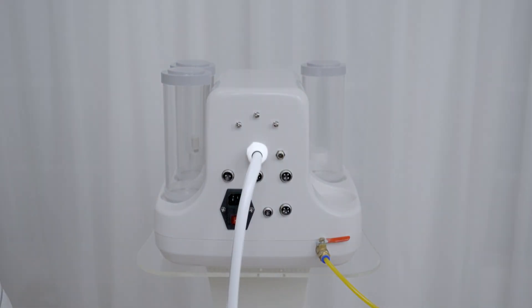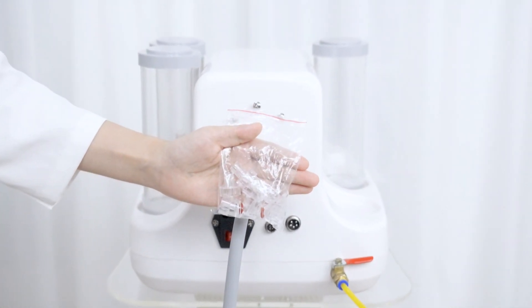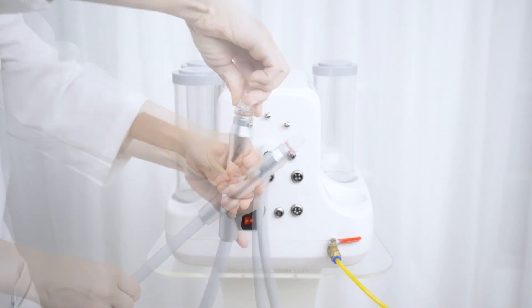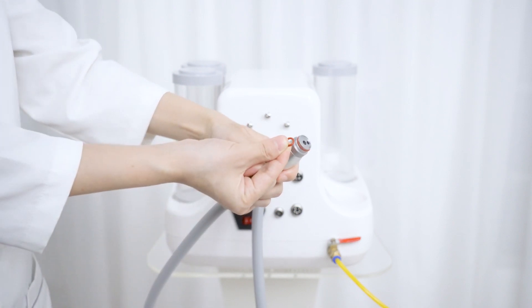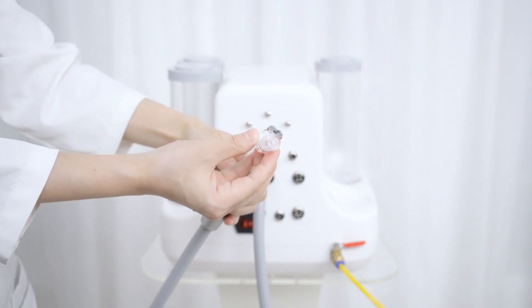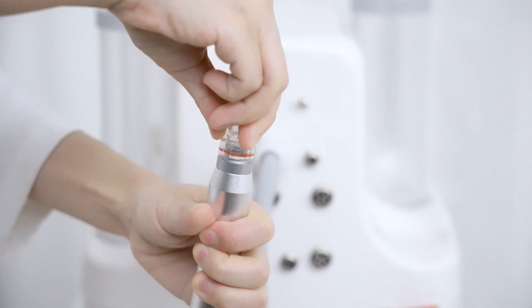The Hydro Dermabrasion headpiece is connected with the main machine. You'll find hydro tips and rubber rings inside the accessories bag. Detach the tip before you replace any faulty rubber ring. Attach the hydro tip onto the handpiece.